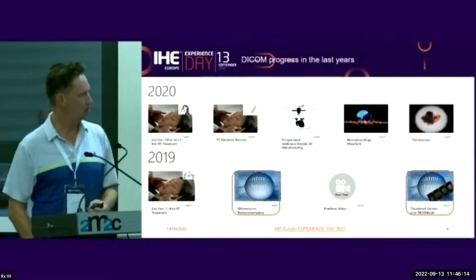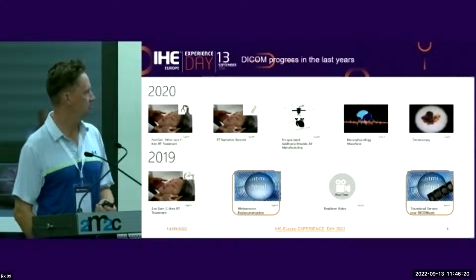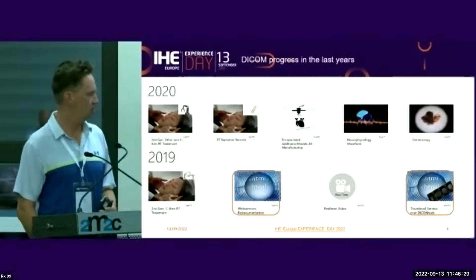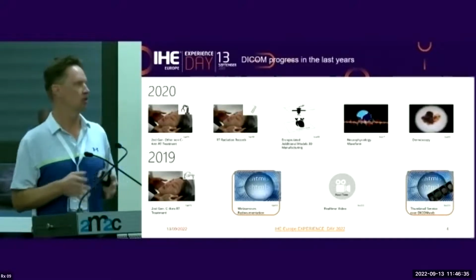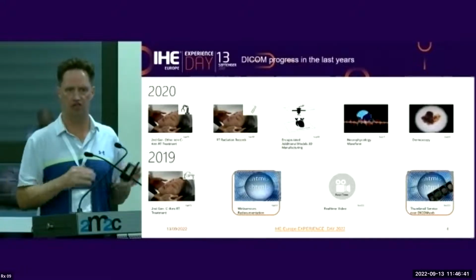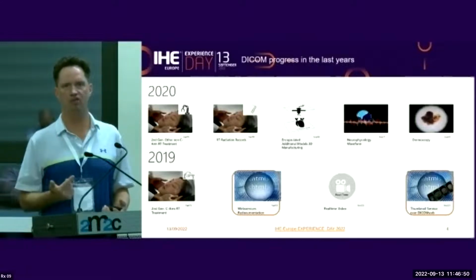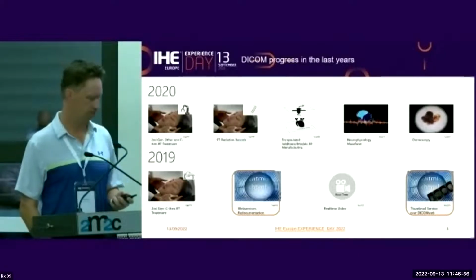And you can also see that there are some further DICOMweb features that were completed in 2019. One is the redocumentation. That means that the whole documentation of all the web services within the DICOM standard was redocumented to conform much more to the web standards themselves, but also to be more consistent when it comes to how error handling is defined in different sections of DICOM and so on. And also another service, thumbnail generation, so that you can use the web interface to generate thumbnails and to show them for different studies and images.